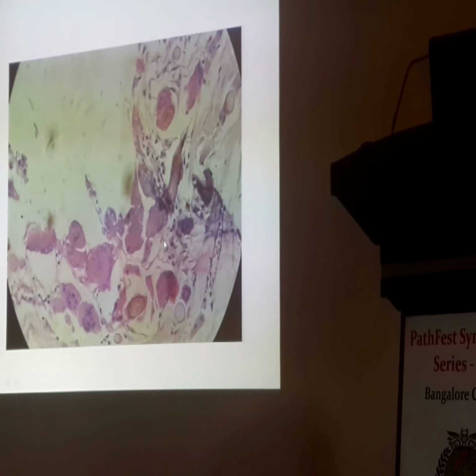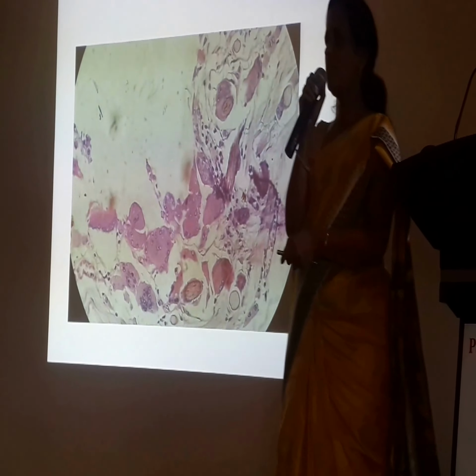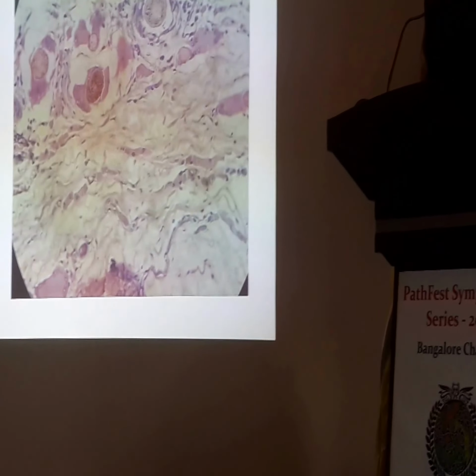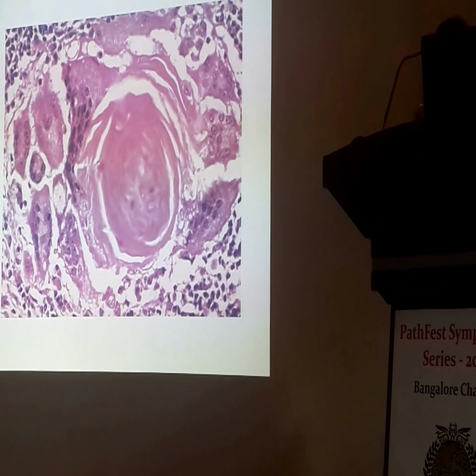Where is the suture material? They use brown suture? Hair. So this is a hair shaft which is giving rise to a foreign body giant cell reaction. See? Very clear. Next. Yes? Cholesterol gives rise to a foreign body reaction. Next. Gout, uric acid. Yes.